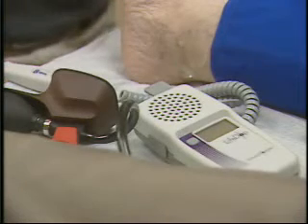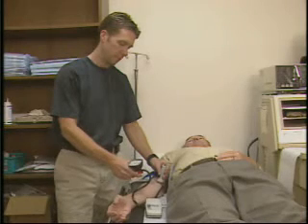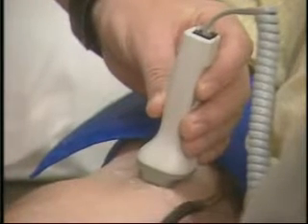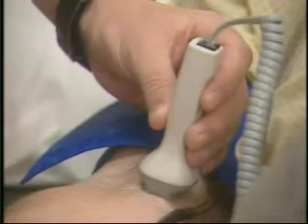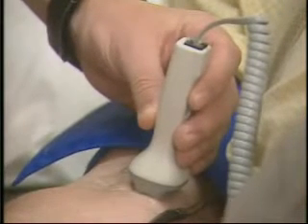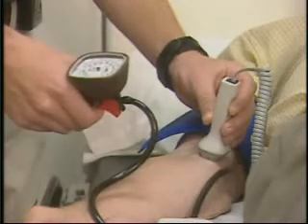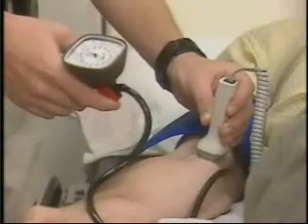Before starting the measurements, arrange your equipment in a convenient position and make yourself comfortable to avoid awkward positioning. To take the arm pressure, wrap the cuff snugly around the arm. Place the probe over the brachial artery. Using only light pressure, slowly move it around until blood flow sounds are clearly heard. Steady your hand on the patient or the table and keep your eye on the probe hand during inflation and deflation of the cuff to minimize movement and to make sure the probe doesn't slip off the vessel.